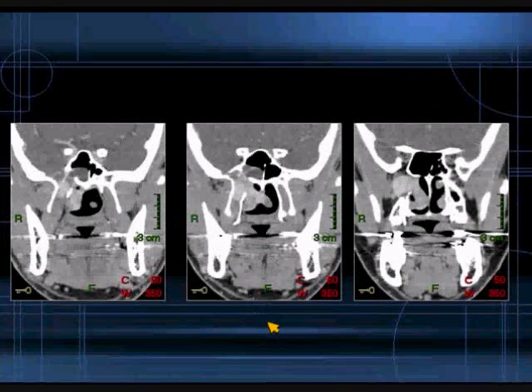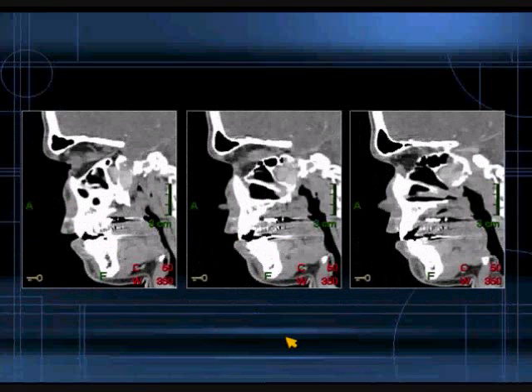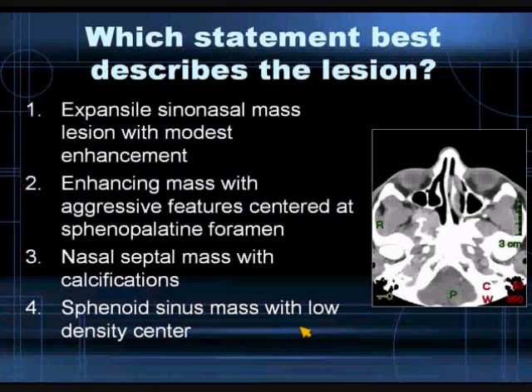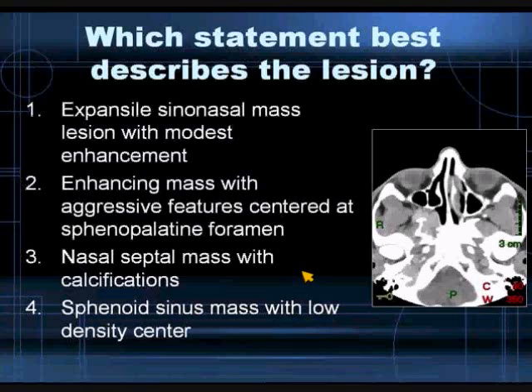Coronally formatted images and sagittal reconstructed images from that same examination. Which statement best describes this lesion? An expansile sinonasal mass lesion with modest enhancement? An enhancing mass with aggressive features centered at the sphenopalatine foramen? A nasal septal mass with calcifications? Or a sphenoid sinus mass with a relative low-density center? Please enter your choice.